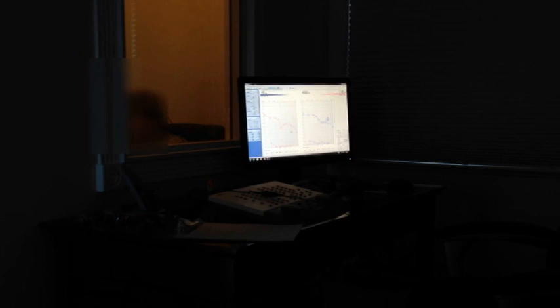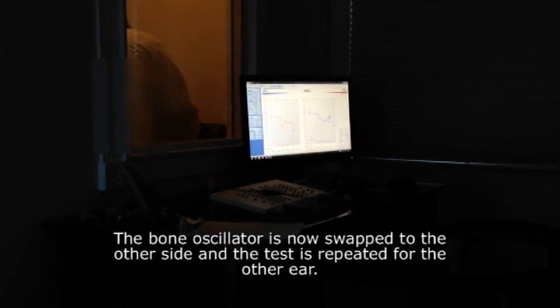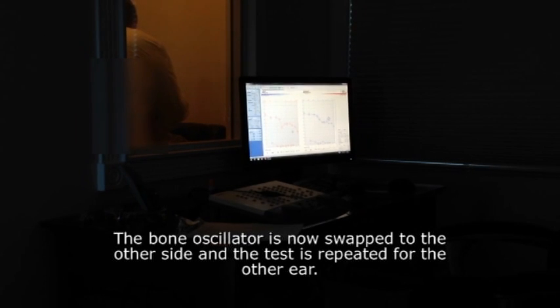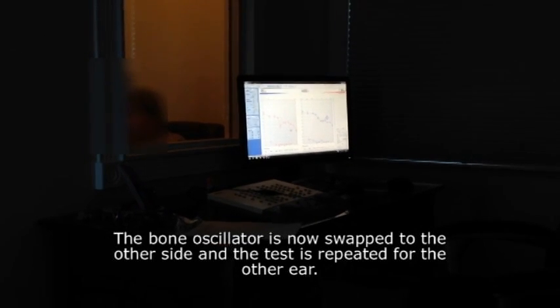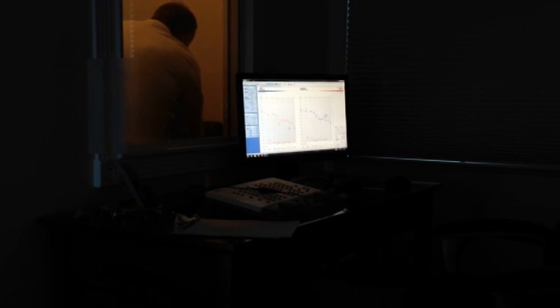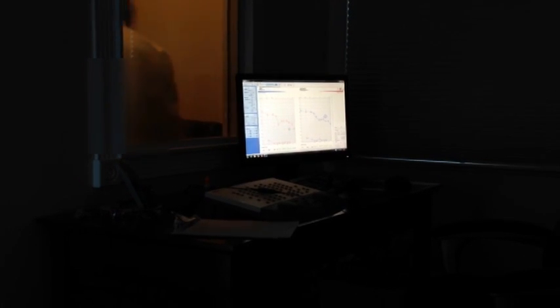Okay, we're almost done. We need to switch this over to the other side for just one pitch. And we'll be done. Put on that low again. We'll have to put this back in for the noise. You'll hear the static on this side again. Okay, same thing.